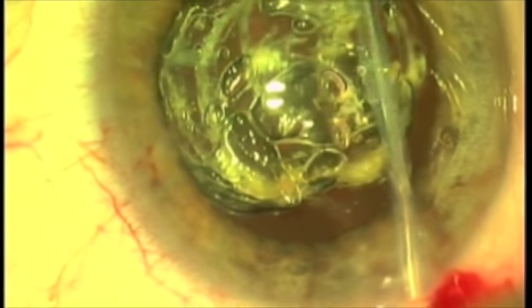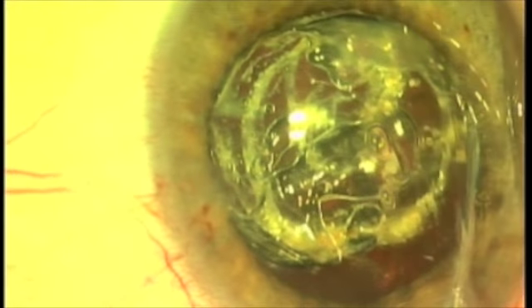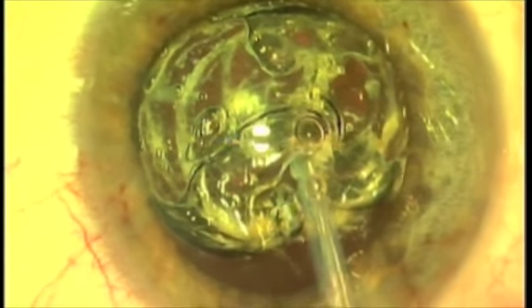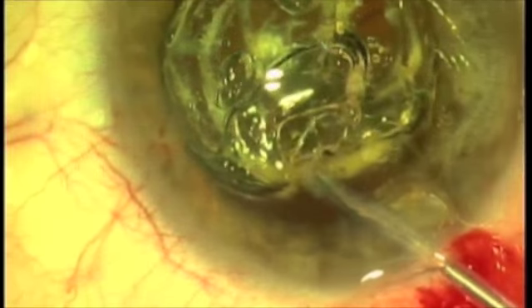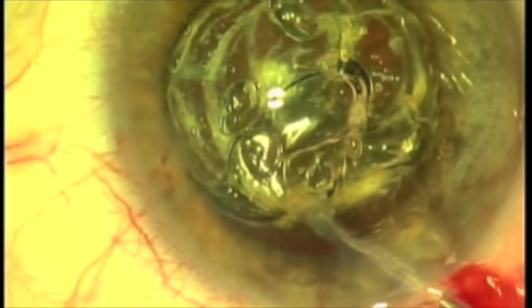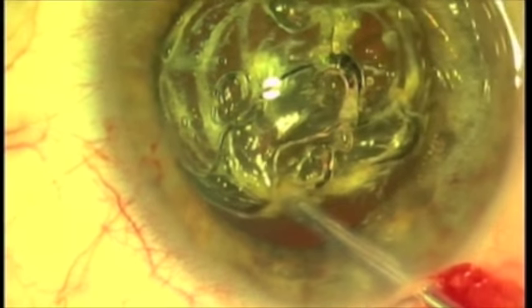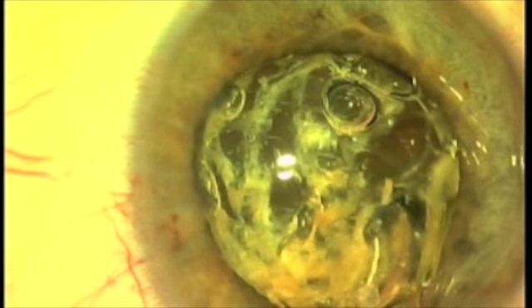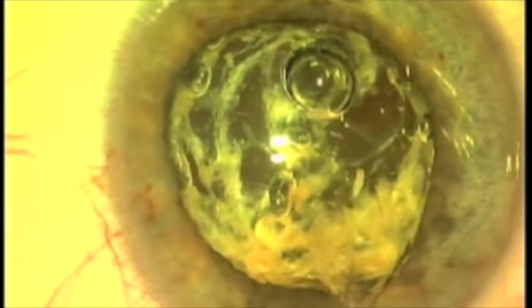What we're trying to show you here is that you have enormous capability. You can do things that are impossible with any other technique. We still have a tiny little crescent down below, and I'm going to take the left-handed portion of that crescent. We are literally erasing that out.